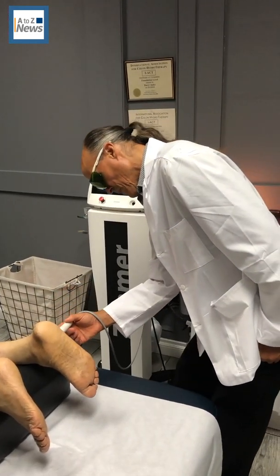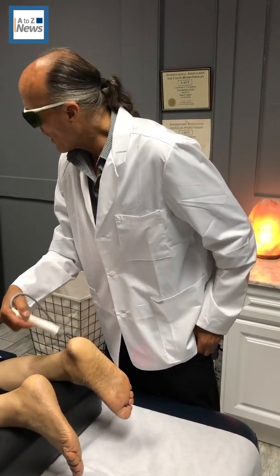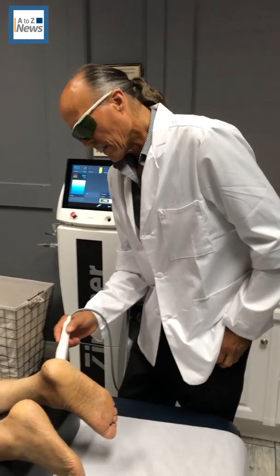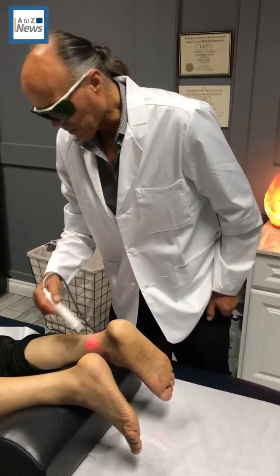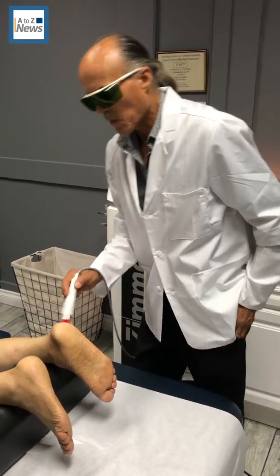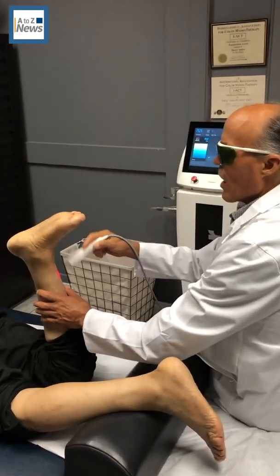We're using this today on a patient with a chronic ankle injury. How long ago was your injury? 15 years ago. It's causing him to limp, which throws out his back and is causing a back problem. The orthopedic doctor has told him he needs to have his ankle fused because he has arthritis. With our help so far, he's making progress and getting better.